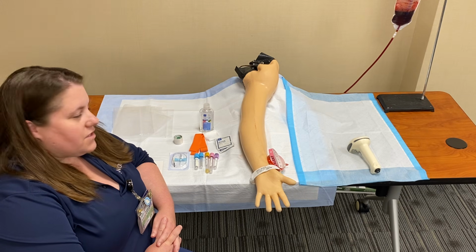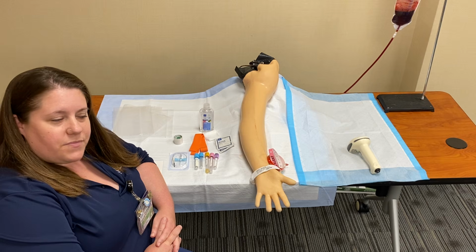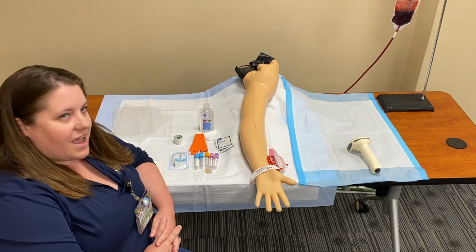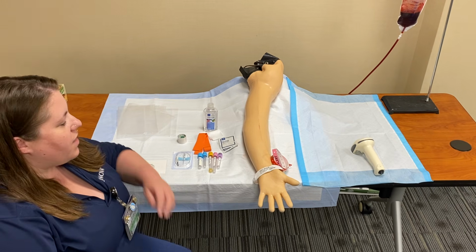I also want to ask the nurse if the patient has any restrictions, is on anticoagulation, or has any allergies. Even if they tell me, I'm still going to double check with the patient. And then I can ask if there's anything else I need to know. Once I've gotten delegation, I'm going to head to the supply room to gather my supplies.